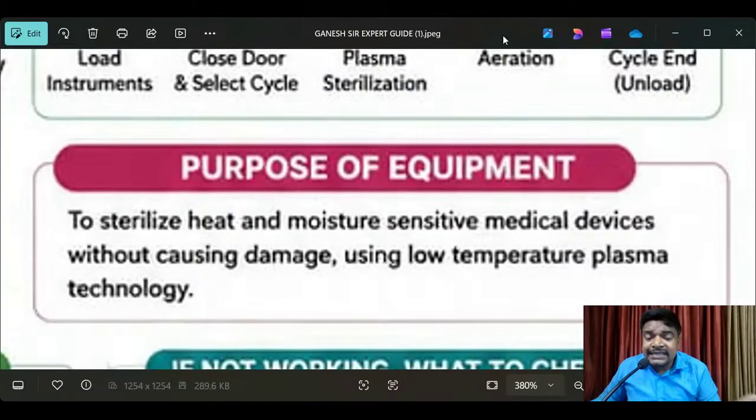And what are the things, the sterilization purpose, we have to do? What are the things I will show you here in this live session? First of all, I will focus on these basic points. Next, the internal components of the medical equipment. Next, the practical way, accessories and everything, what things need sterilization, those things I'm going to share in this live session.